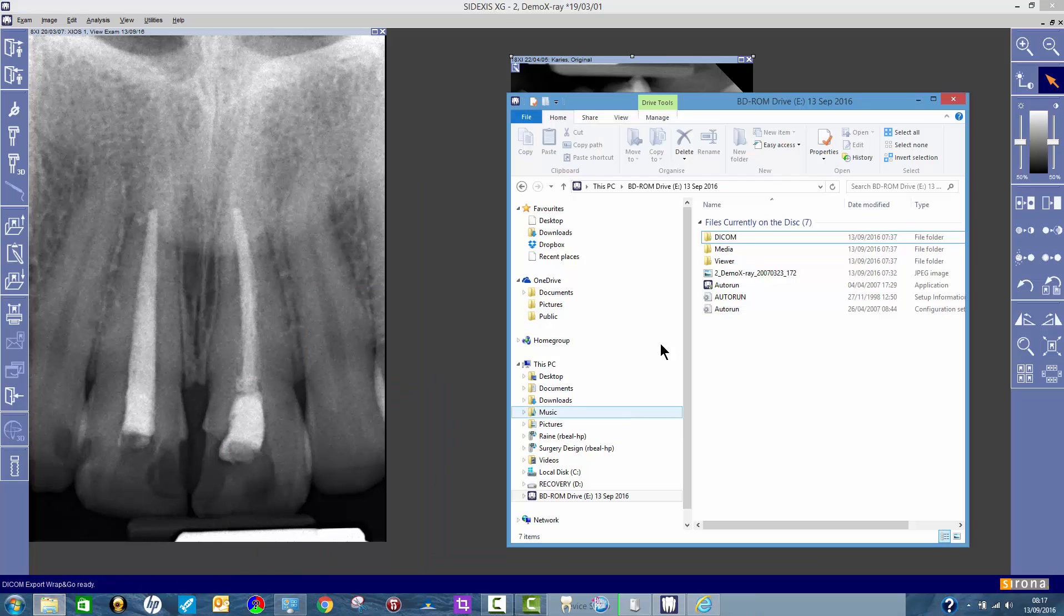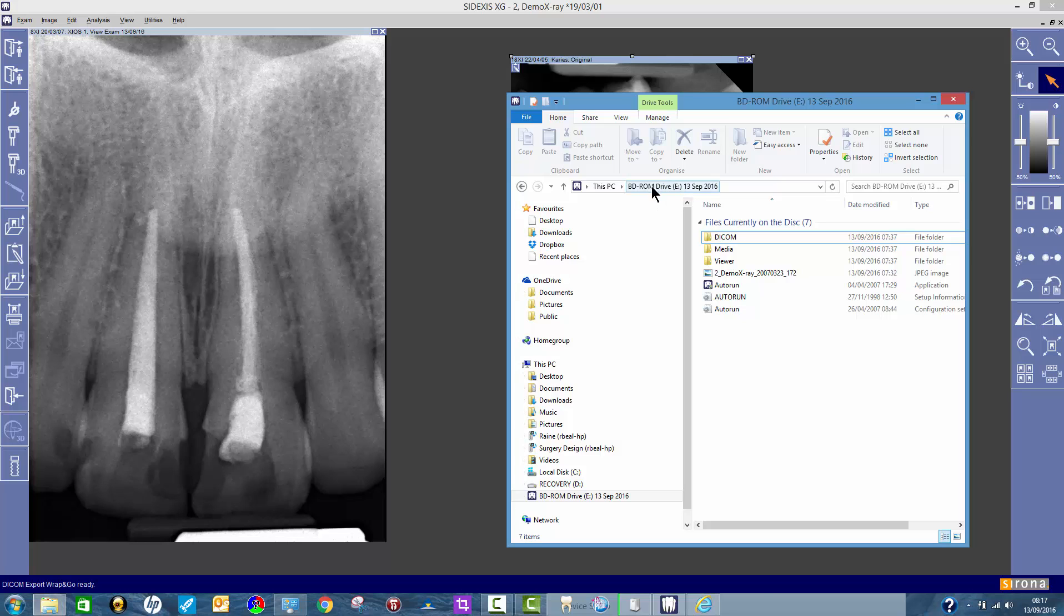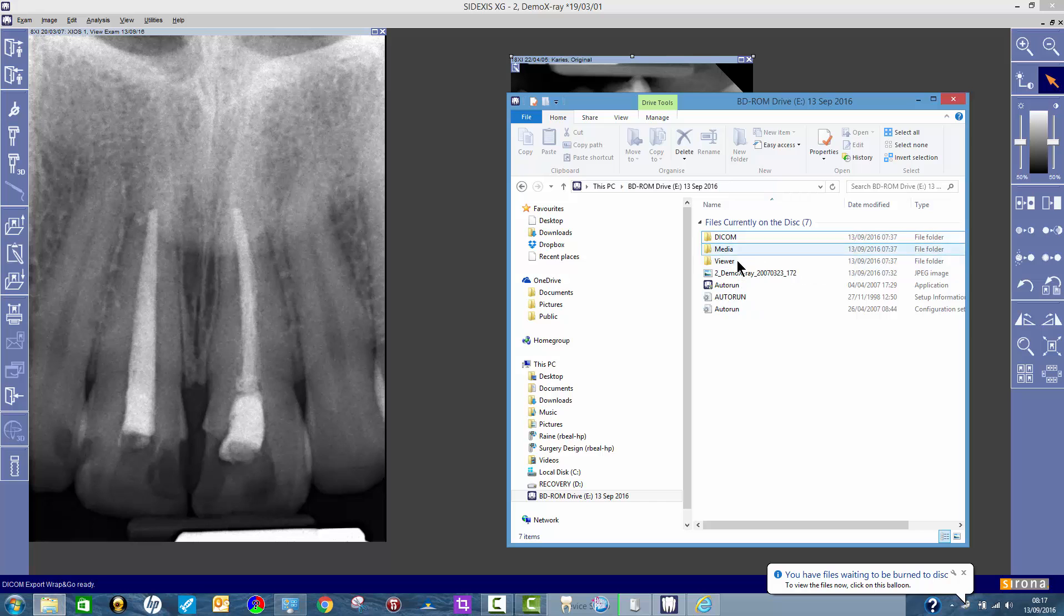So here's one I prepared earlier. If I now go to my E drive, which is where my disc burning drive is, there's my files that I would have burnt.